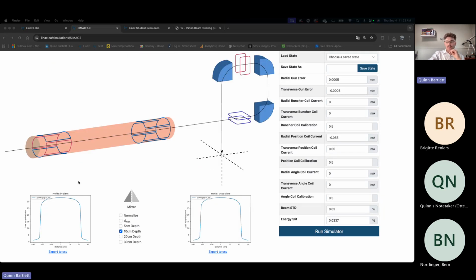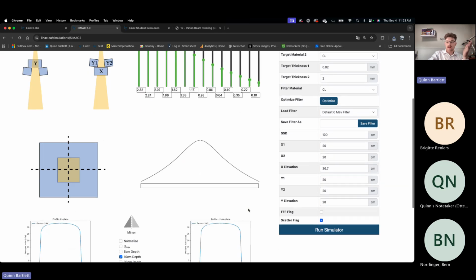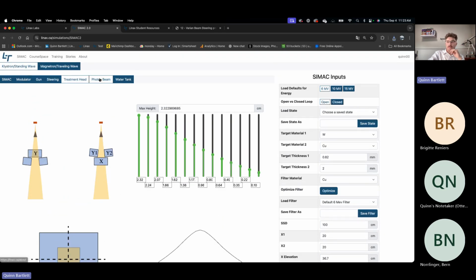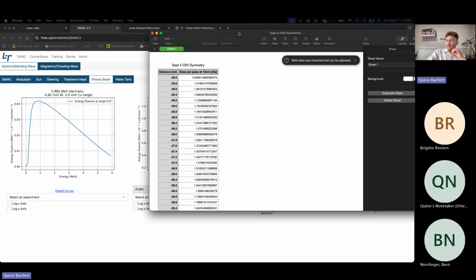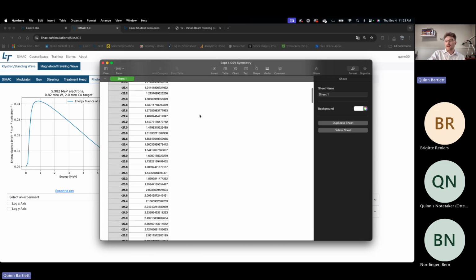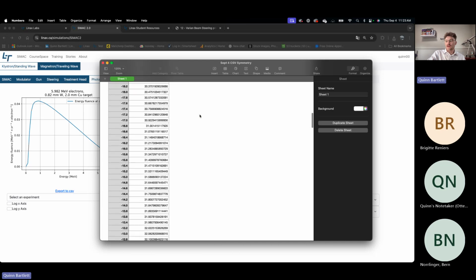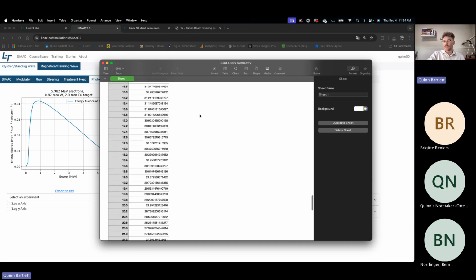And again, you have to download it separately for the in-plane versus cross-plane. And then for the flatness, it's a little bit different. And on the photon beam, you have to do it separately for the PDD. But quickly, you can see this is what the results output. It gives you the dose per pulse at 10 centimeters for each distance away. So you'd be able to take that data, plot it, run it through any manipulators you'd like, and do whatever you'd like with that.